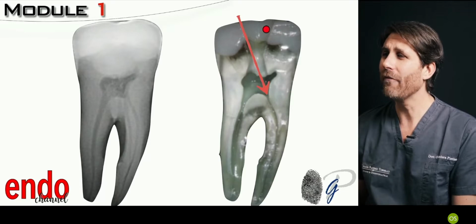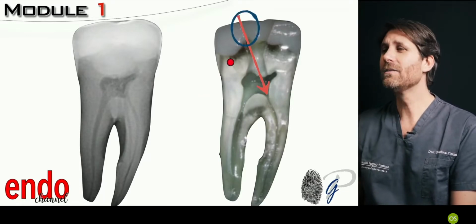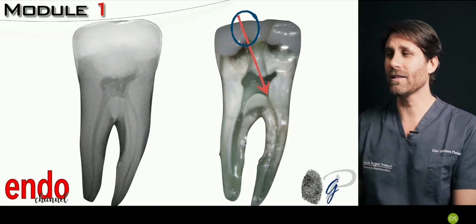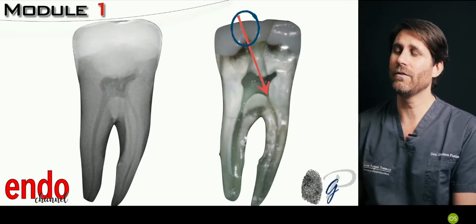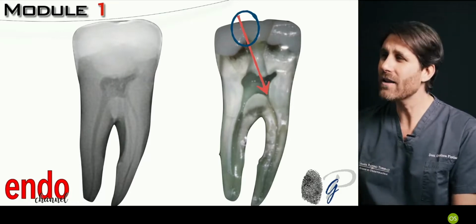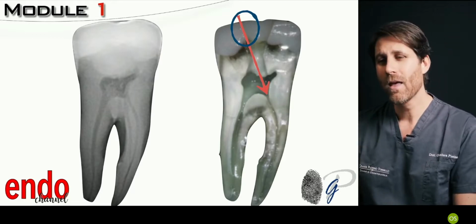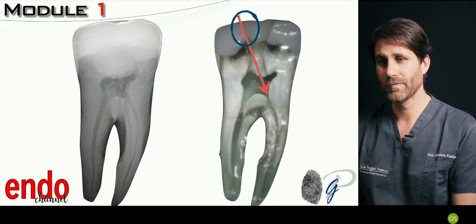So this bevel on the occlusal surface aims to remove this undermined enamel, to reduce this interference from the straight line entrance of an instrument in the orifice-directed direction. So the straight line that we like is the straight line of an instrument towards the orifice-directed orientation, not a straight line perpendicular to the occlusal surface of the tooth.